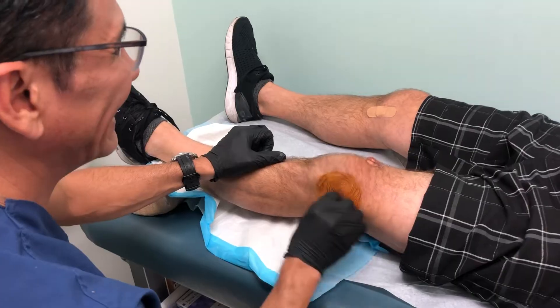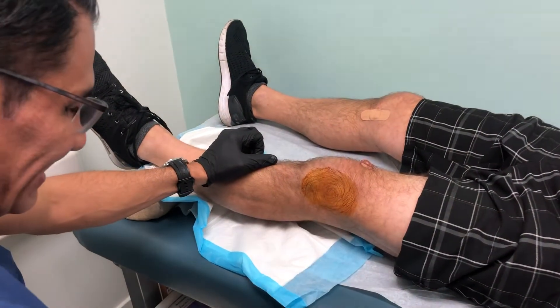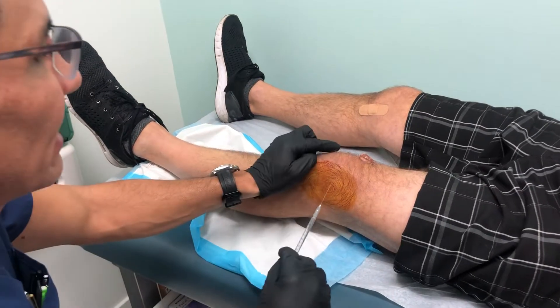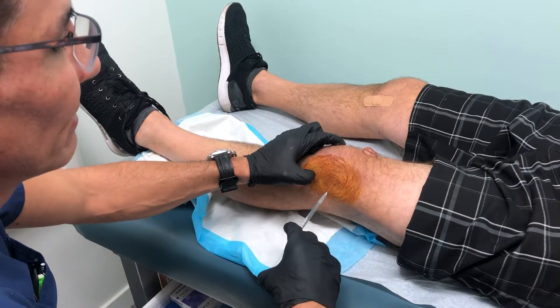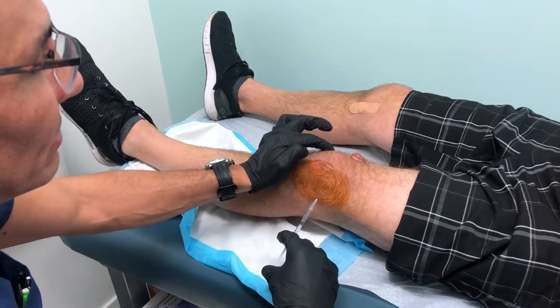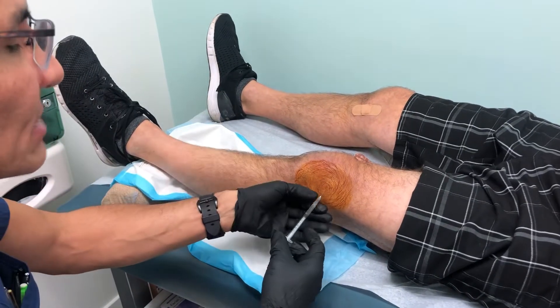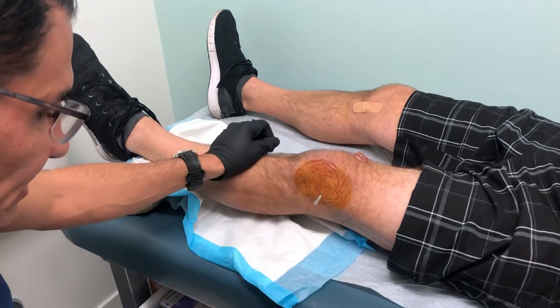He's like a typical patient who wants to stay as active as possible and not have a joint replacement. I'm going to numb you up over here, okay Steve? What I'm doing right now is injecting a little bit into the skin and tissue and the joint right here. I can tell I'm in, and then I'm injecting it. What's nice is that he's been able to stay active.